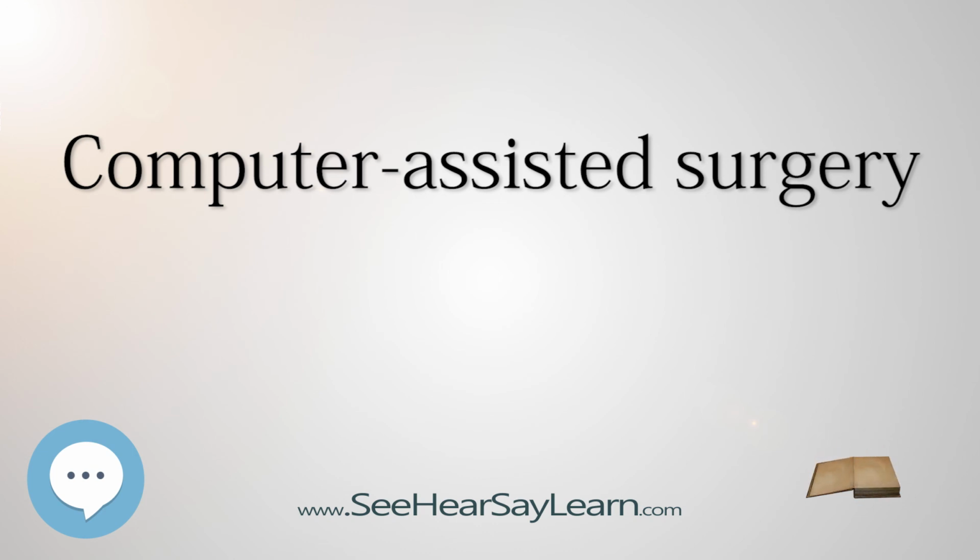Disadvantages. There are several disadvantages of computer-assisted surgery. A major disadvantage of this system is their cost. With a price tag of $1 million, their cost is nearly prohibitive. Some people believe that improvements in technology, such as haptics, increased processor speeds, and more complex and capable software will increase the cost of these systems.